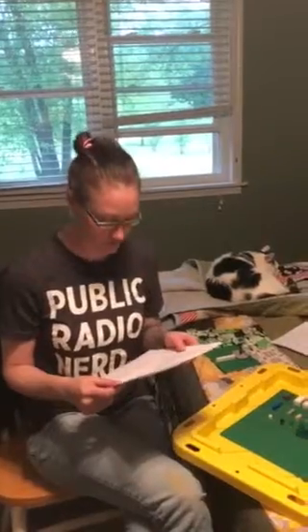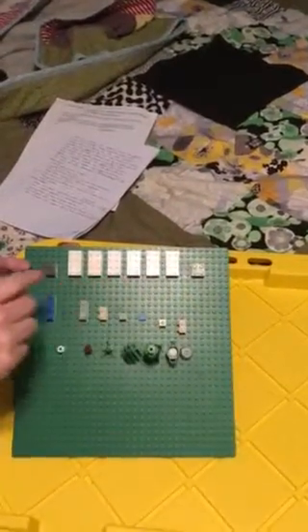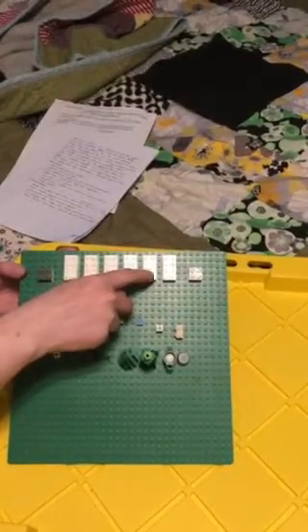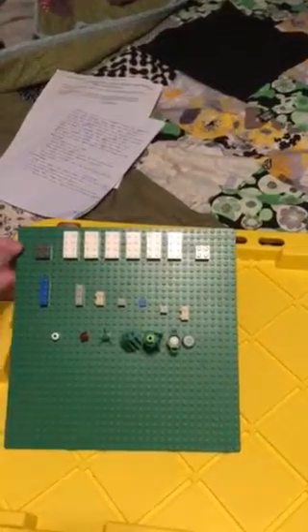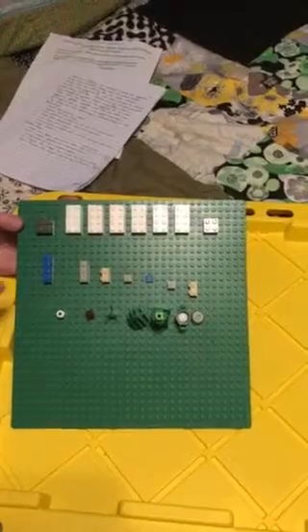So we come over here to my diagram. These small boxes represent your 90-degree RF pulse, and these are your consecutive 180-degree rephasing or refocusing pulses. So the time between these two is your TR.